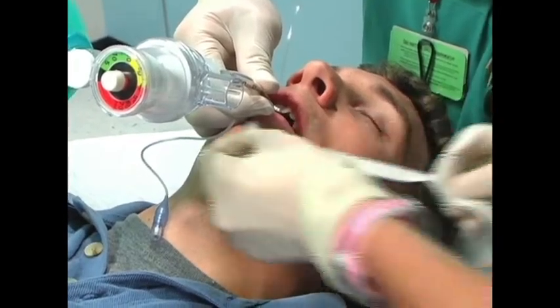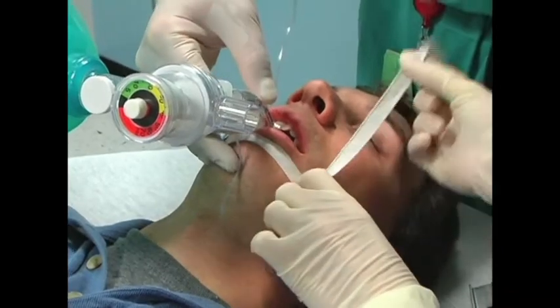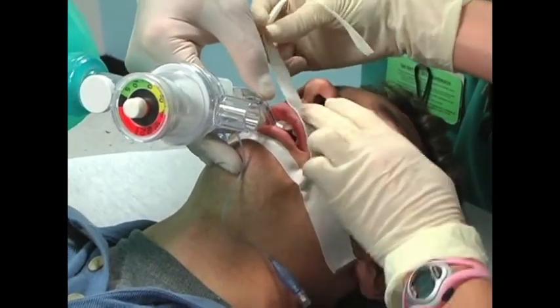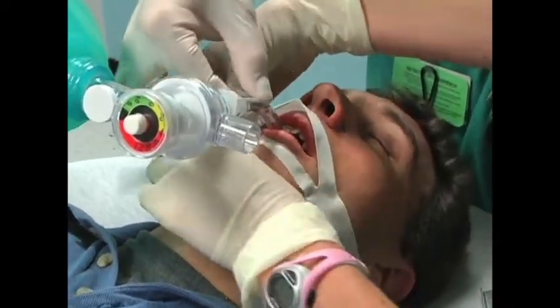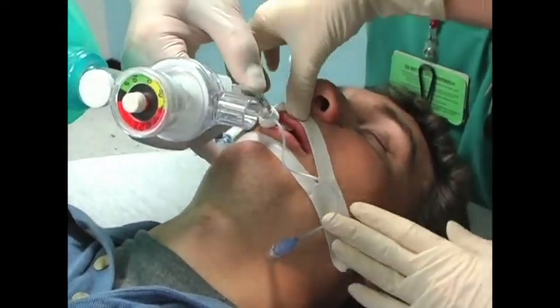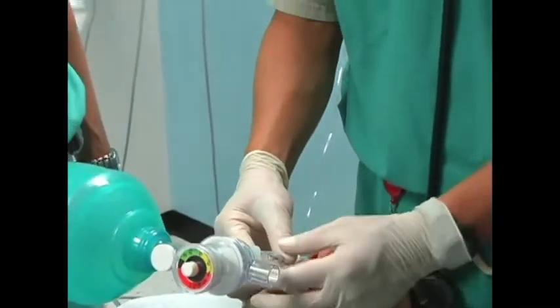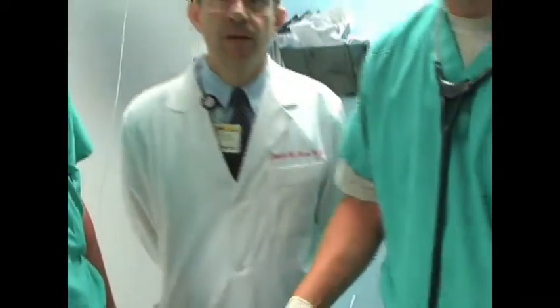The tube is now secured in place using tape. You've just witnessed an endotracheal intubation facilitated with the use of pre-treatment agents. We'll now examine each of these steps in detail.